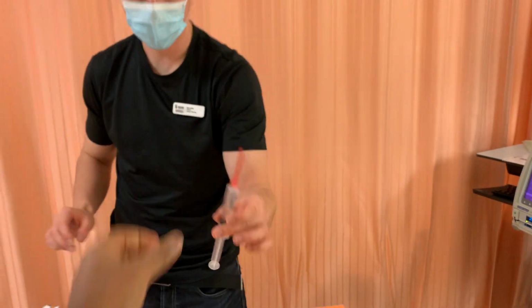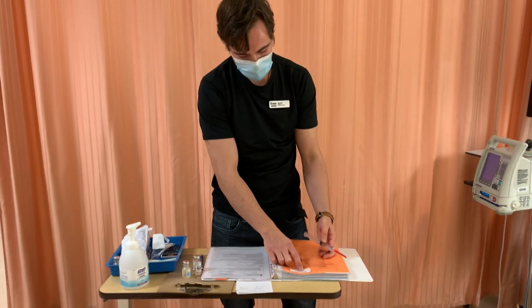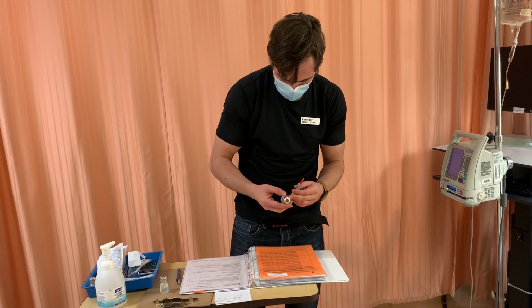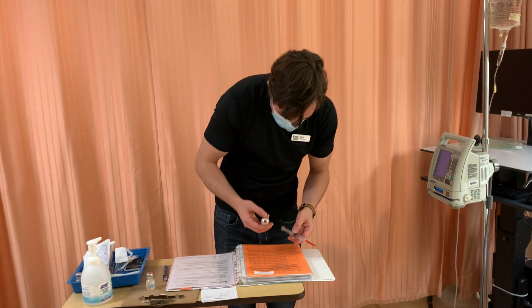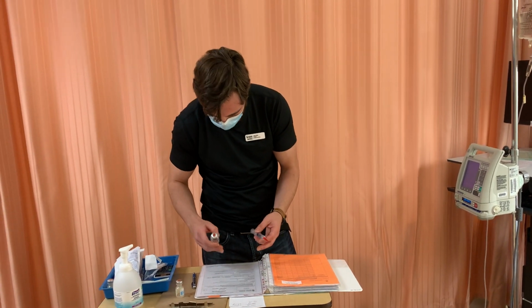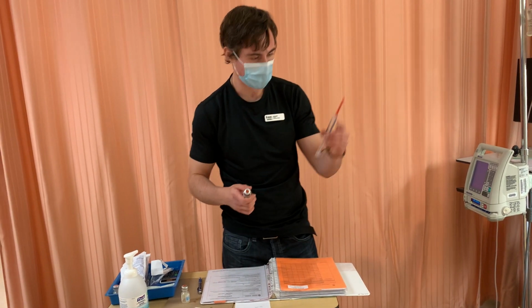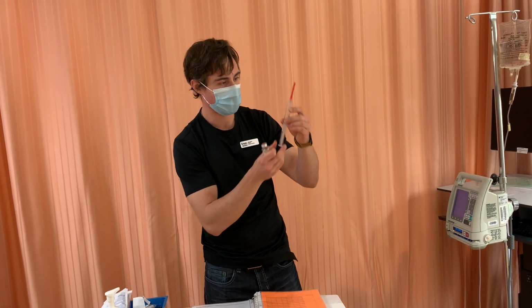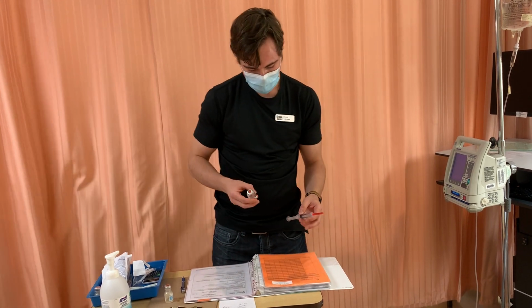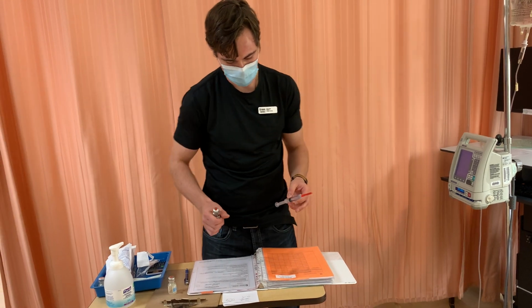Okay. So next I'm going to do my second check here. So we have for Vancomycin, that's the right patient. Right drug is Vancomycin. So here we have our Vancomycin. Right dose, 500 milligrams. I have 1 gram in this vial and at a concentration of 50 milligrams per ml. So I have 10 ml, and I have checked here. I do have 10 ml with no bubbles. So that's the right dose. Right route is IV. This is for IV. Right time frequency is Q12H. It was given last 12 hours ago. So it is now time to give it.